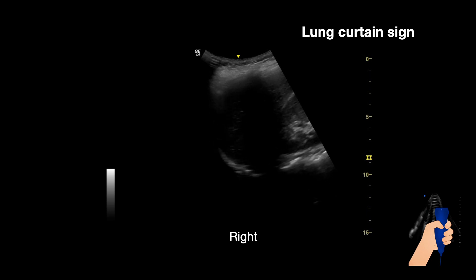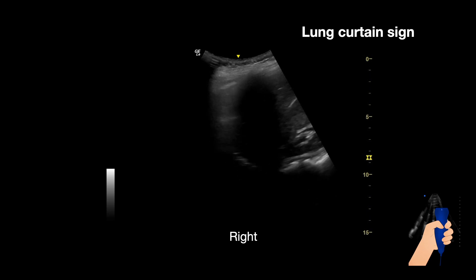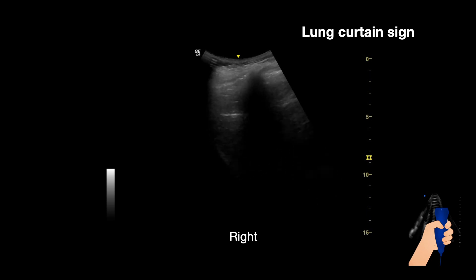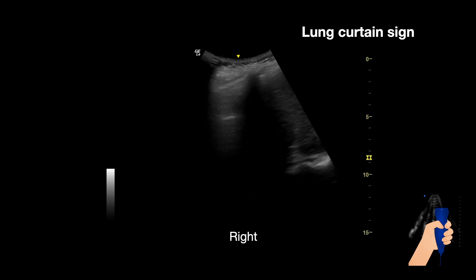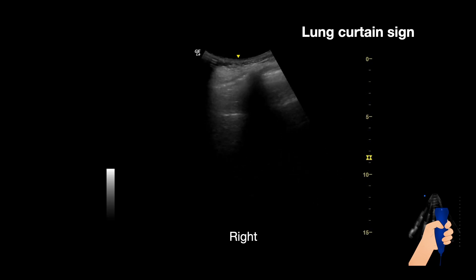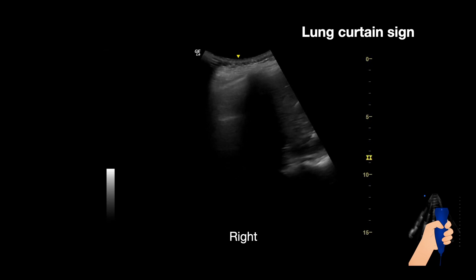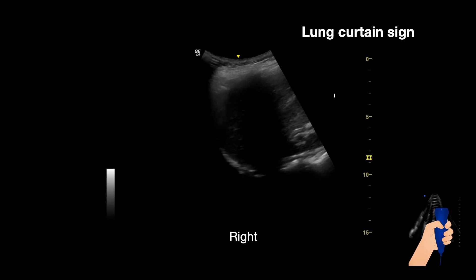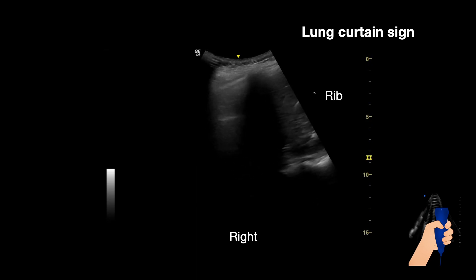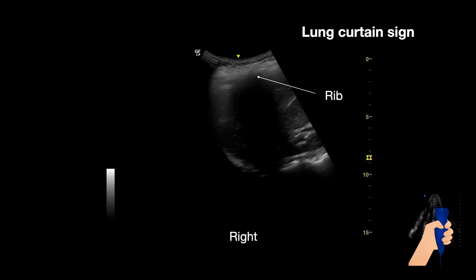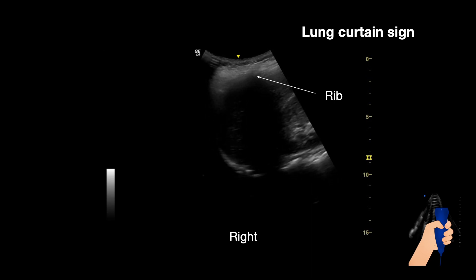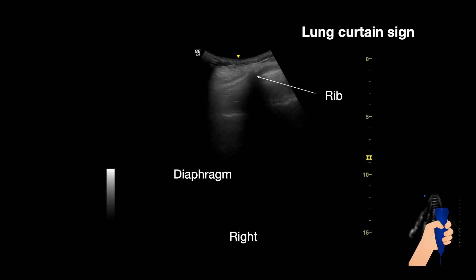This video shows a normal lung curtain sign. The lung curtain sign looks like a curtain. A lines enter the visual field when respiration occurs. Here we can see a rib right in the middle causing an echogenic shadow. Then we can see the diaphragm coming in and out.